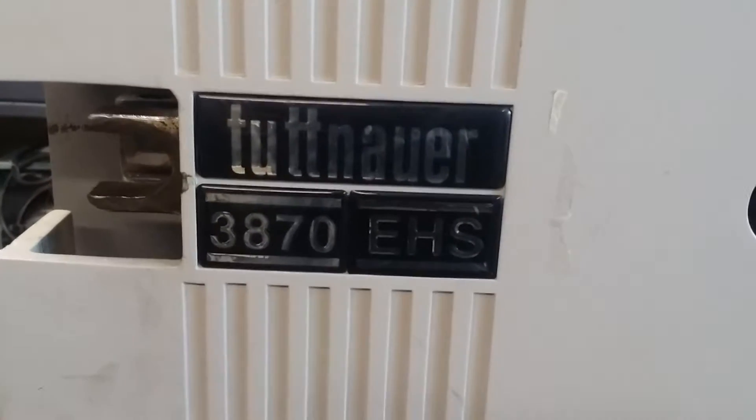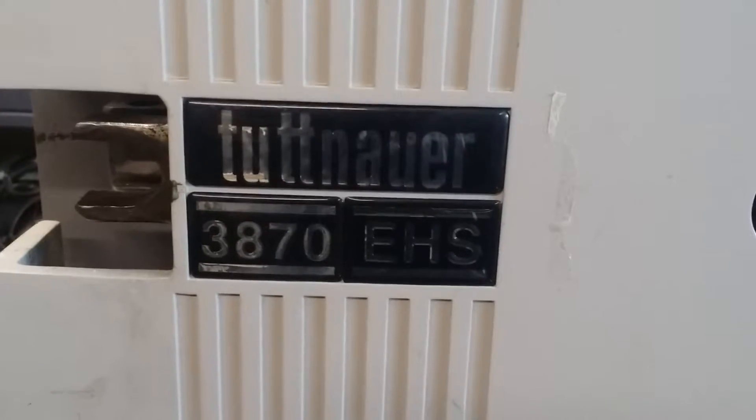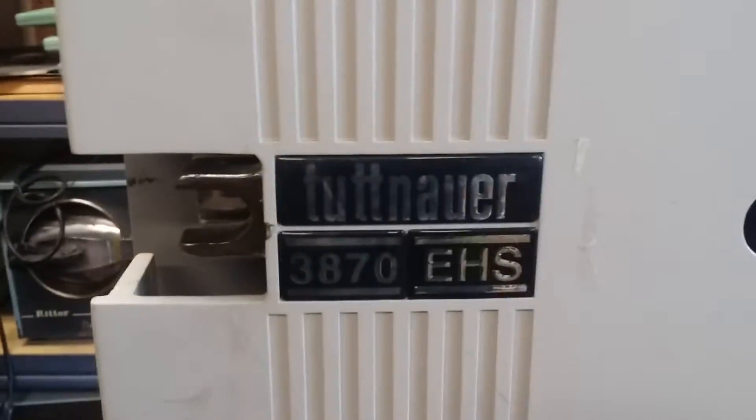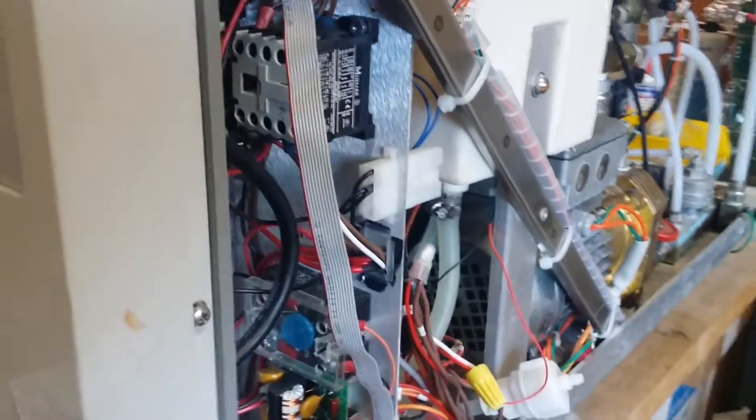This machine's design is very similar, actually, to another Tudna sterilizer. This one is called the Tudna EHS — the Tudna 3870 EHS and 2540 EHS. This is a very good machine, very advanced, preheat and pre-vacuum — a very advanced sterilizer too.